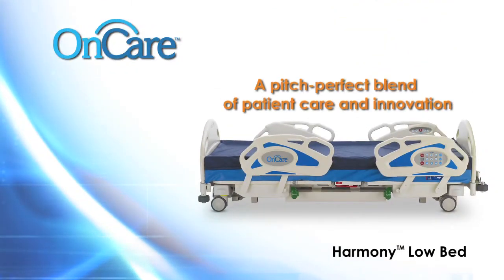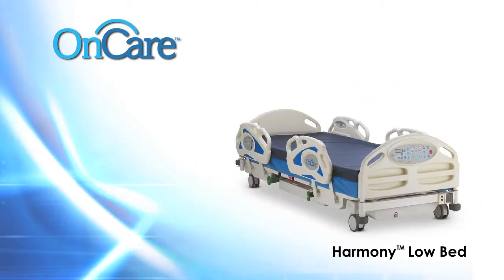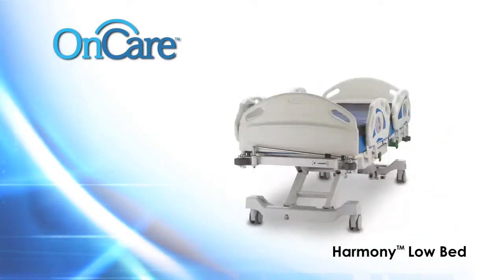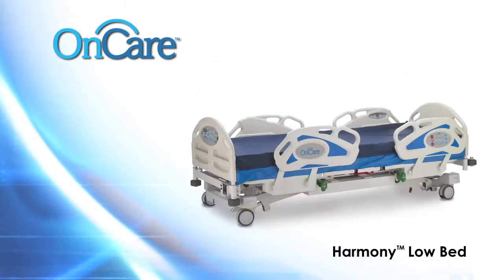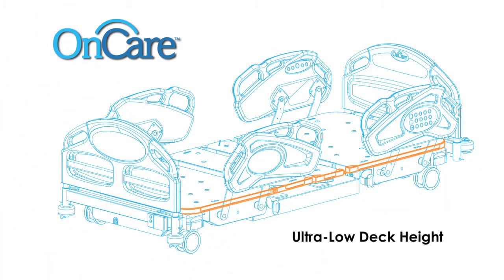Introducing the OnCare Harmony Lowbed, a pitch-perfect blend of patient care and innovation. The OnCare Harmony Lowbed was built with the insights gained from working alongside caregivers in thousands of facilities every day. With a long list of innovative standard features, the Harmony rises above the competition by helping caregivers achieve optimum patient safety and outcomes.